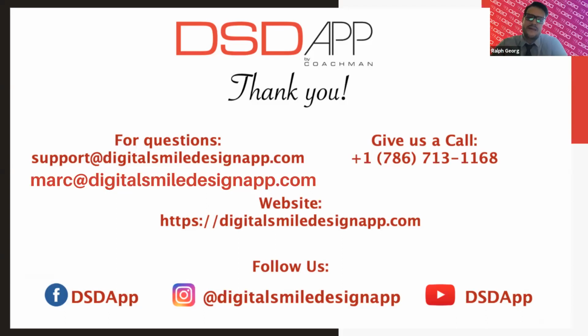That's a great point. That DSDApp by Coachman is not just for you, the clinician. We have thousands of cases where the doctors bring in their team members, they become empowered, they feel like they're a part of the team, and they're doing the simple smile simulations. While you're with one patient, your front desk girl is doing a simple smile simulation.